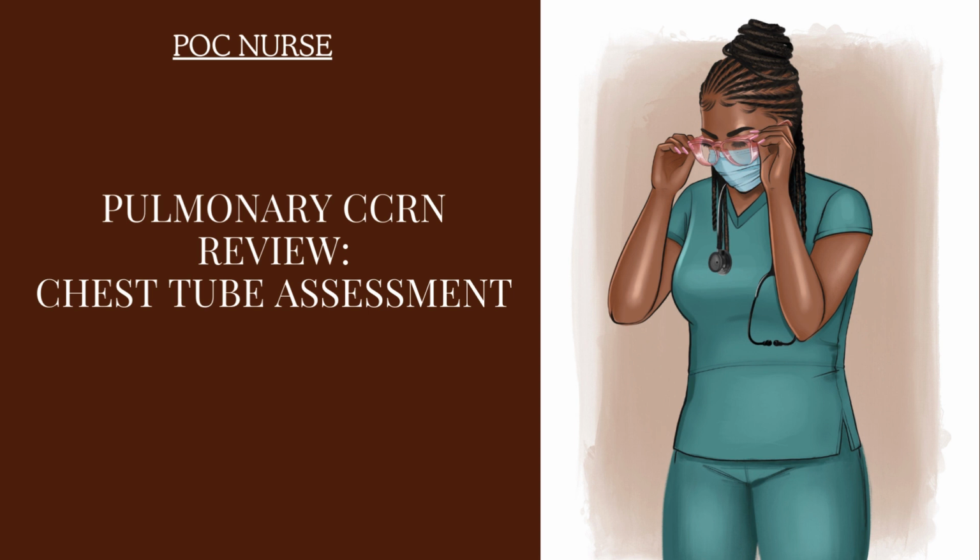The patient might need a new chest tube placed. The patient might need surgery. So your respiratory assessment of your patient that's in respiratory distress is important. You may need to get help quickly. So that's it with respiratory distress as a complication or problem with the patient that has a chest tube.